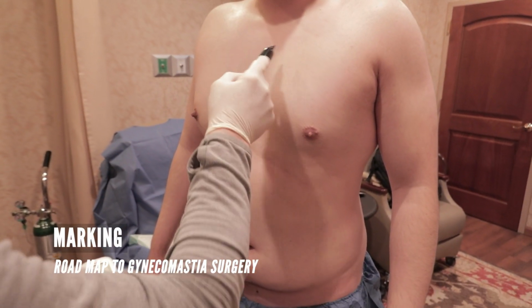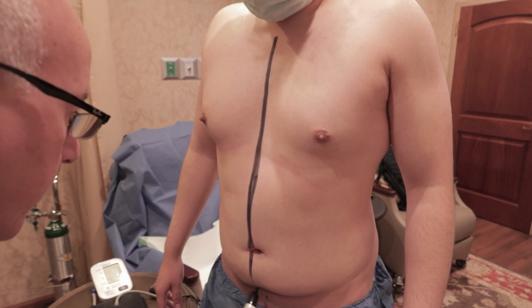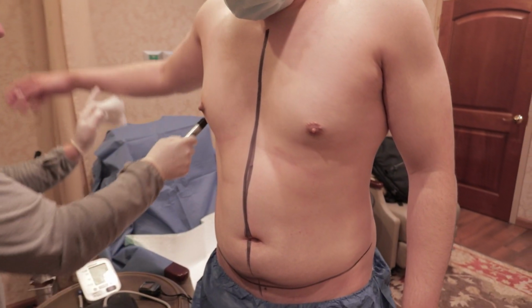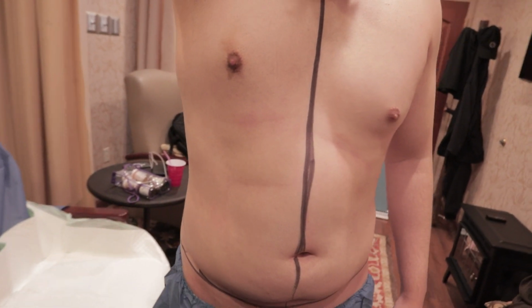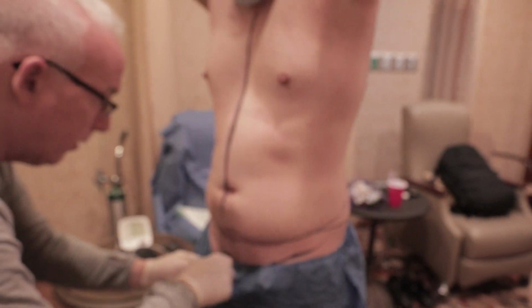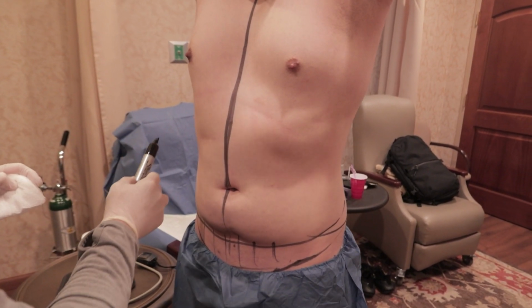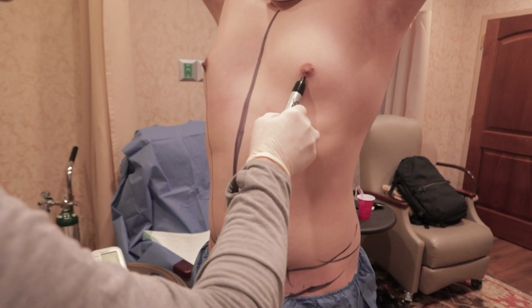All right, so let's start marking him. Midline, boom, all the way down here. What I'm doing first is framing him, doing the outskirts of what I want to do. Of course, get way back there. Lift up there. Get way back here. Now get over here a little bit. I want to get this so I can even that up. Suck in your belly. There you go. The V to P, as I call it. Right here.